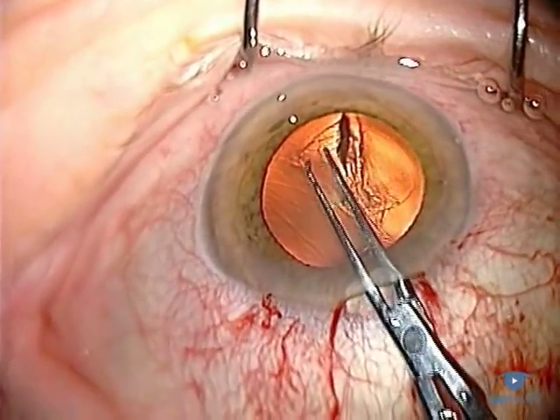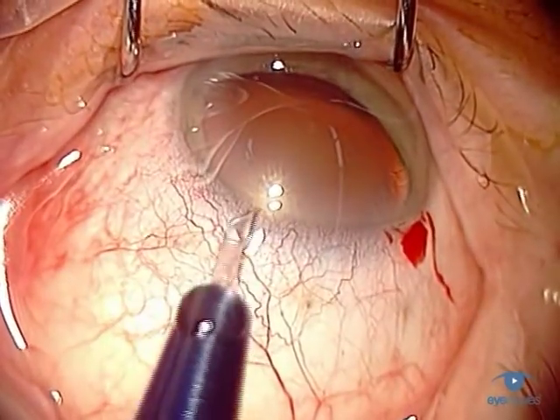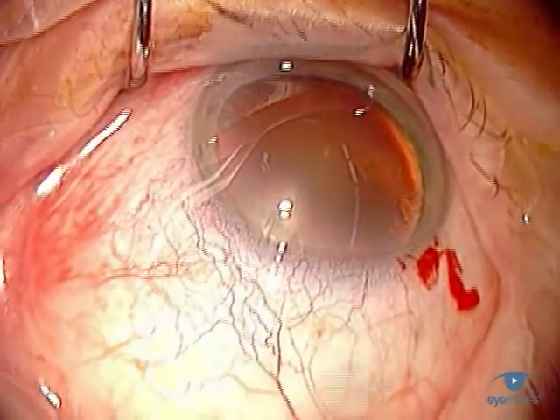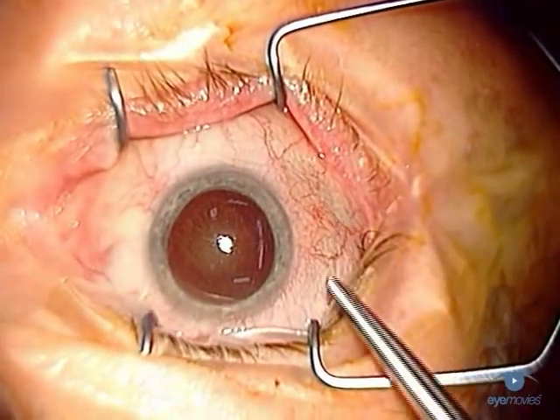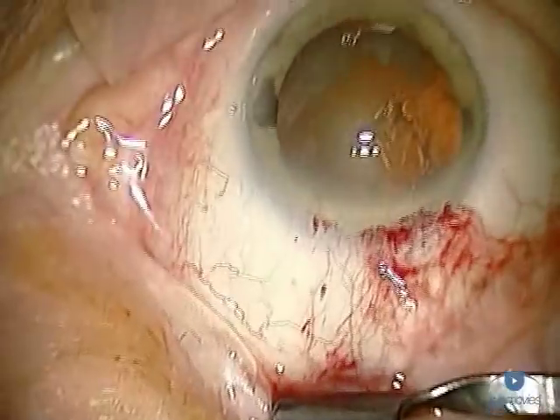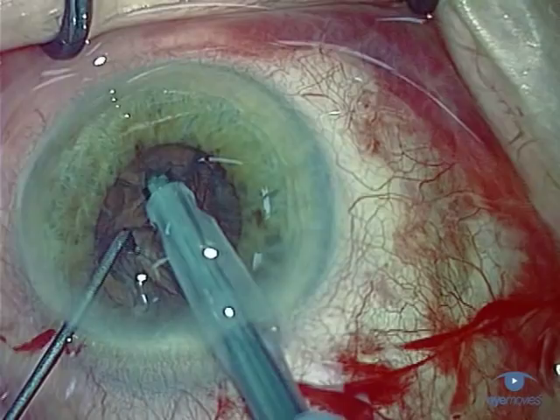You can minimize significant eye movements by engaging the patient's cooperation at the beginning of surgery as mentioned. They can then place their eye in the preferred position for you. This turns the presence of voluntary eye movements to positive advantage. Secondly, the intact sensation of periocular tissues. This is something you have to remain aware of, because inadvertent traction on the speculum or stimulation of the lids can trigger a forceful squeeze or sudden head movement. This can also happen in response to a subconjunctival injection at the end of surgery, so beware.